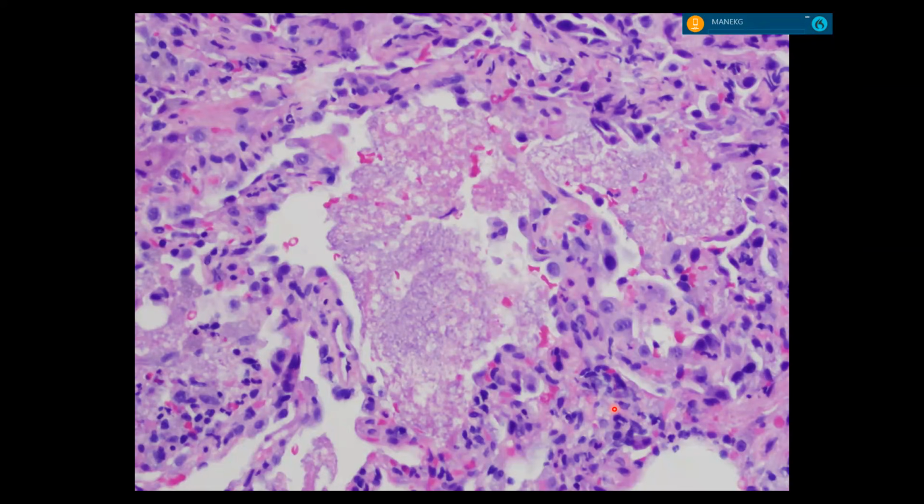The alveolar lumens are just flooded with this stuff, and it's all inside the air spaces, which we call the alveolar lumens. And then the interstitium, the alveolar septa, is inflamed. So that's what you saw first, the lymphocytes. That's what you expect to see. All the pinks, and the pink stuff is all organism. There are the dark pink, like here. This stuff. All the dark pink clumps, like amyloid type stuff, in the middle, along with the gunk in the center.